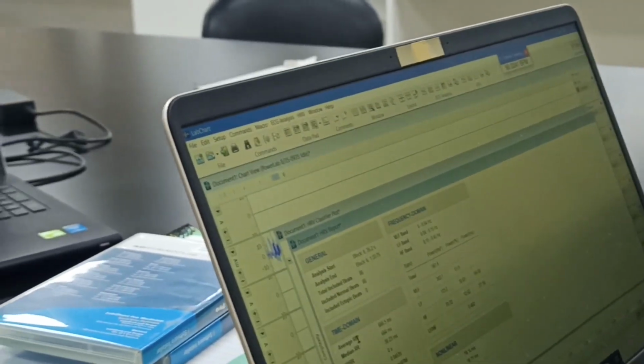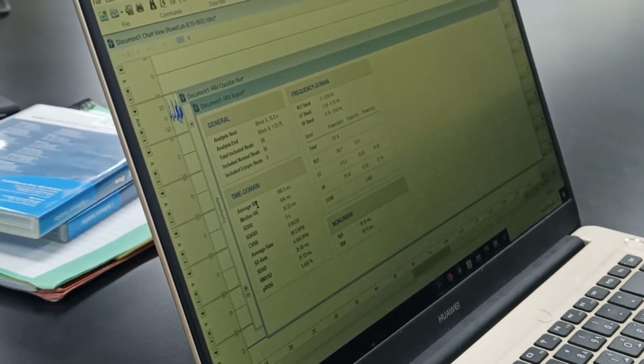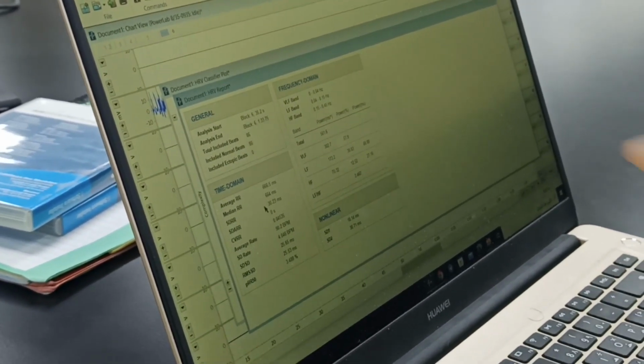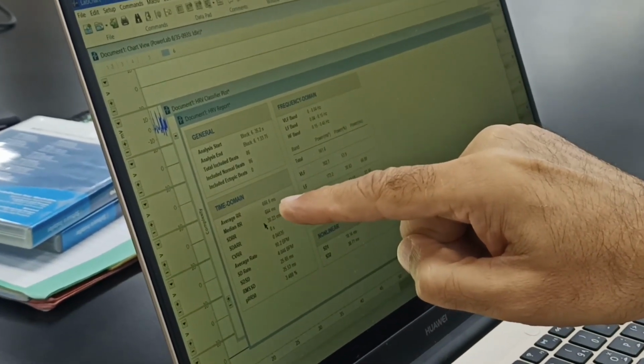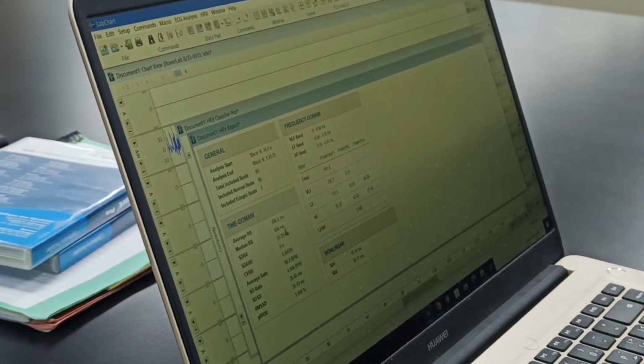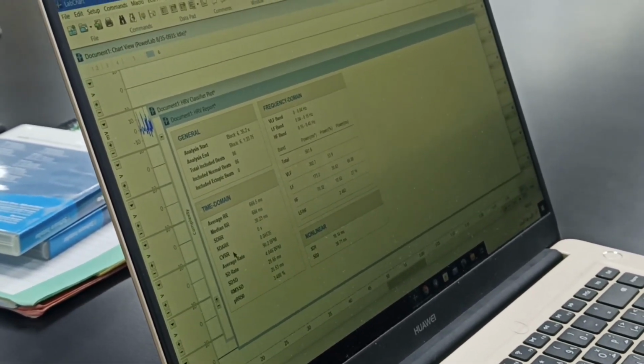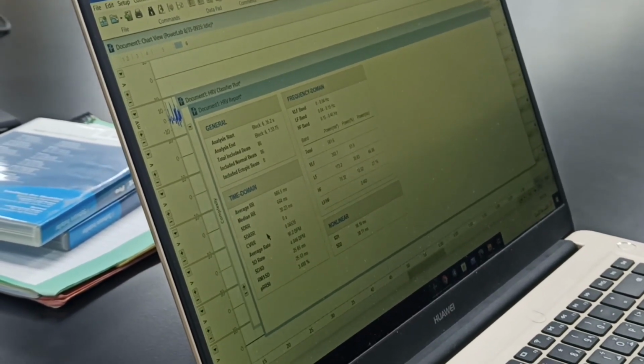Then the average RR interval, peak to peak interval. As I mentioned, there was a difference of 0.697 second. So the average RR interval here has been calculated as 666 milliseconds. Median is 664. Now the rest of these are statistical calculations that the program is doing by itself.